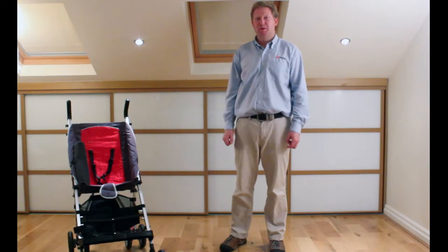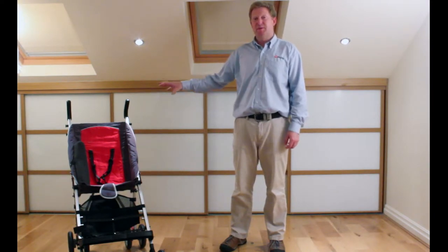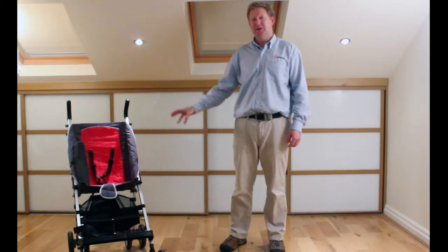Hello, my name is Clive Taylor from DoAbility. I'm just here to demonstrate some of the special needs accessories that go with the Do Buggy.